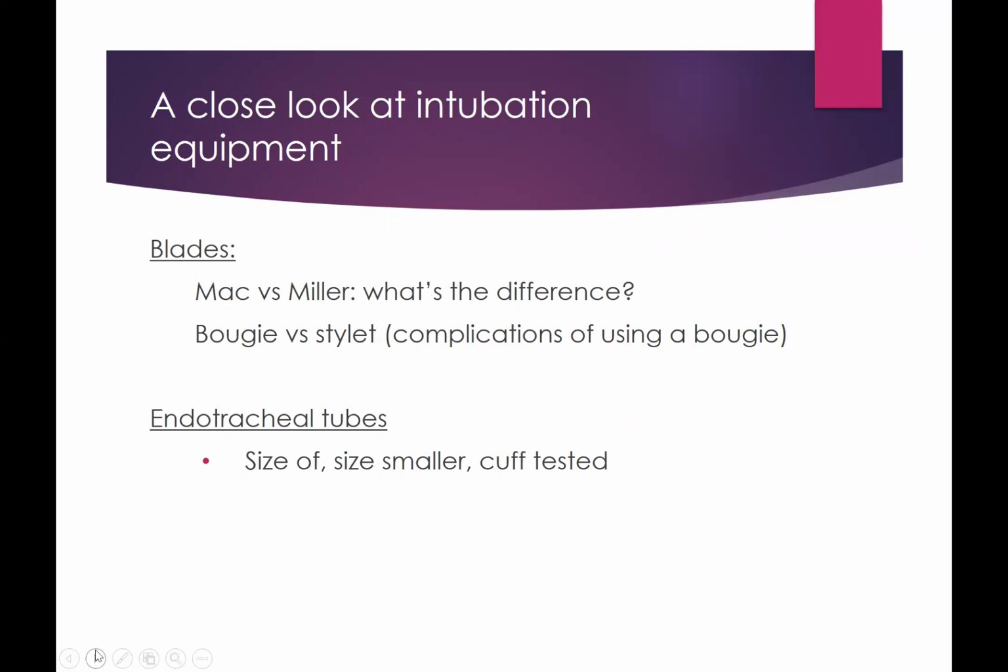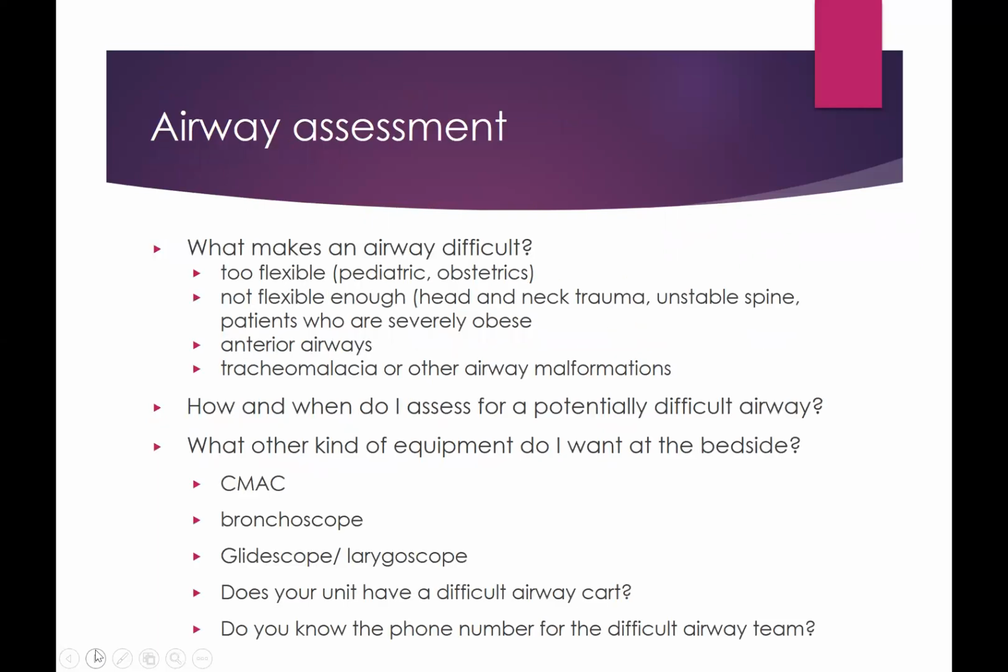And just some other pieces of equipment that we use. Airway assessment, I'm really going to skip over some of that because it's the onus of the physician who is performing the procedure. But it is nice to know a question that can be easily asked. As a nurse, certainly the expectation is not that you're assessing the difficulty of the airway.